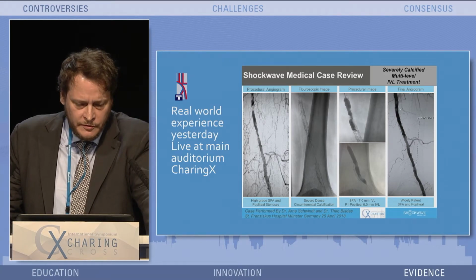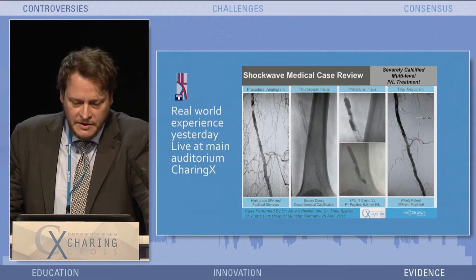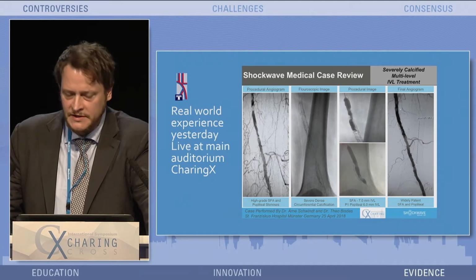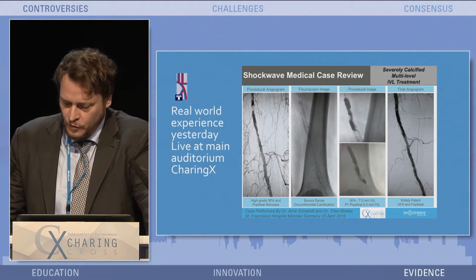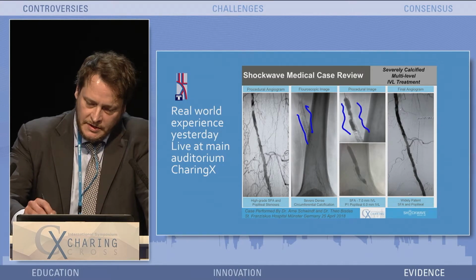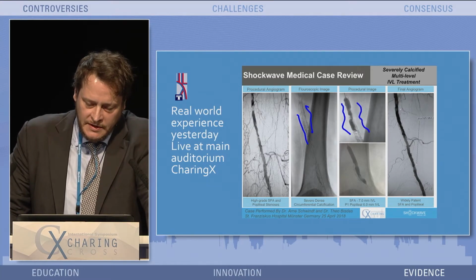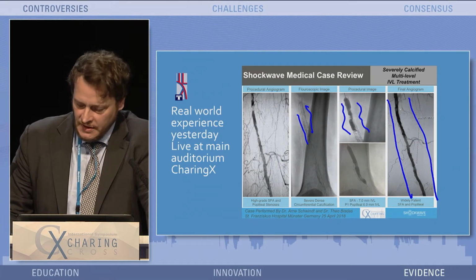I put here for you this case I did together with my friend Theo live at this meeting. A rock-like calcified vessel. It was a kind of vessel where my first mentor told the patients, like, you could break your legs, sir, and walk on your vessel calcification. And you see bilateral calcium in the wall, like here and here. And you see how much the balloon is waisted at the low atmosphere, and at 4 atmospheres, hitting these lesions with 180 impulses each, we were able to open it and receive this very nice reconstruction you see here in the end.